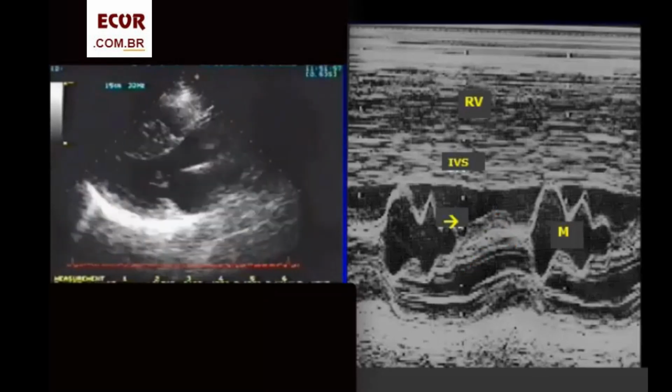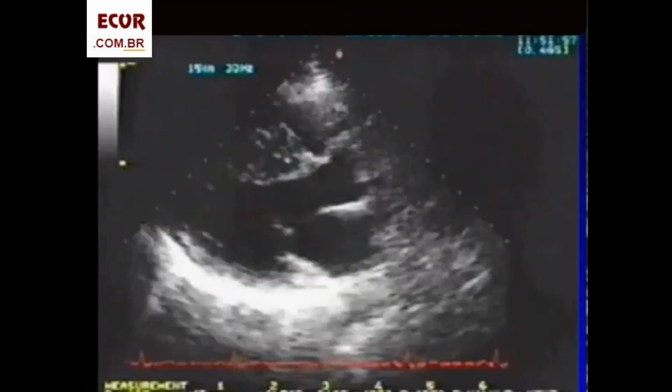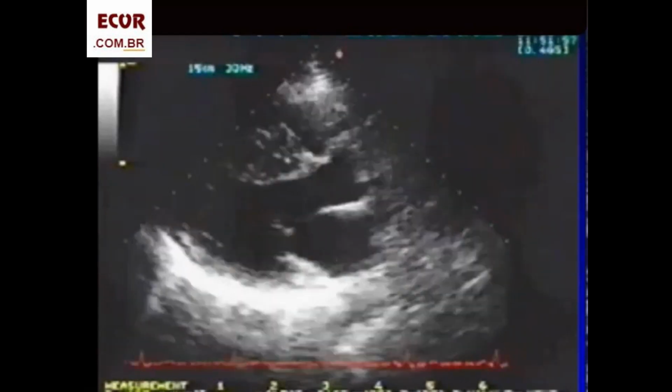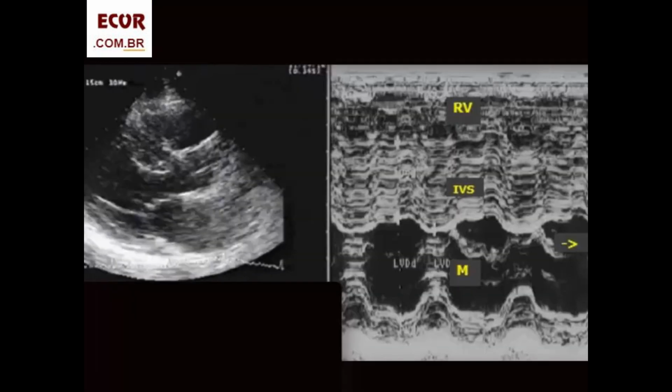Some patients present a SAM which does not touch the IVS. These cases are associated with patients with no rest gradient, but who present gradients when the LV cavity is diminished, like with exertion, some medications, or with Valsalva, for instance. And then the SAM reaches the IVS.